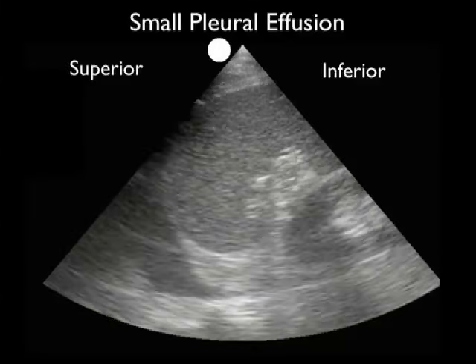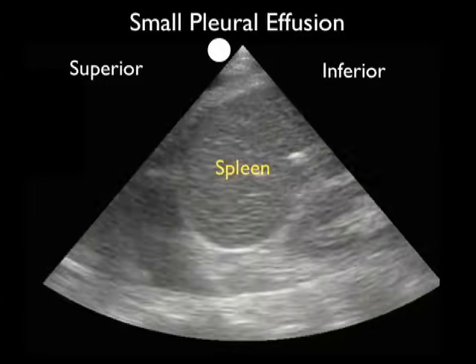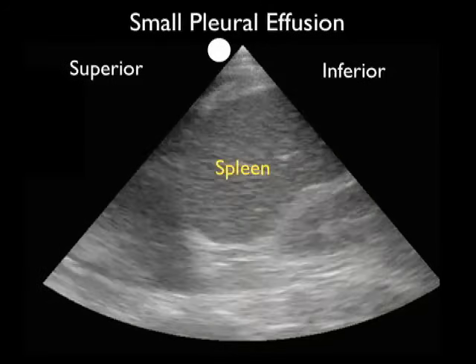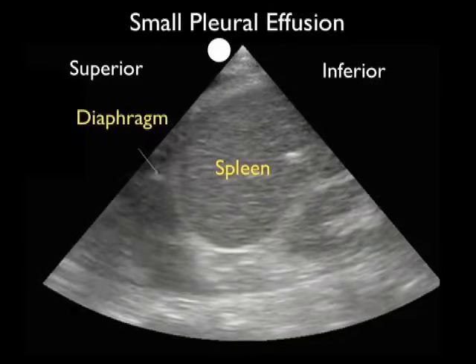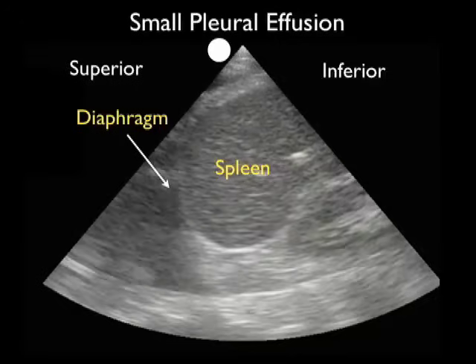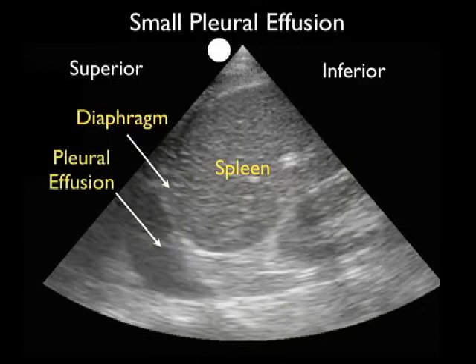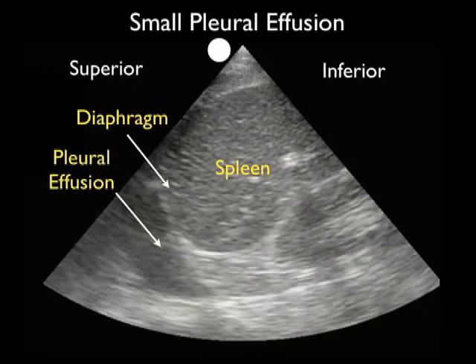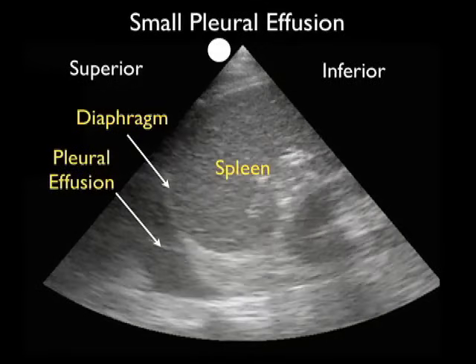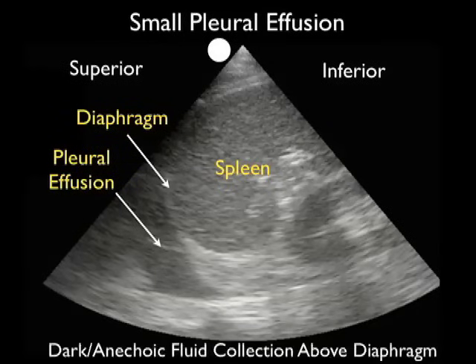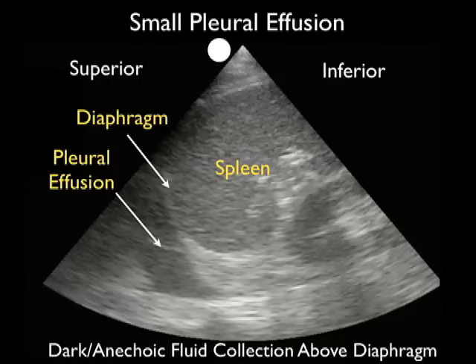Here's a video clip showing a small pleural effusion as taken from the left upper quadrant view. We see the spleen in the middle of the image, the kidney inferior to the spleen, and the diaphragm — the curving white line moving up and down as the patient breathes — right above the spleen. As we look into that area above the diaphragm, we appreciate the presence of a dark or anechoic fluid collection above the diaphragm. This represents a positive pleural effusion. Notice the amount of fluid is relatively small, and we can actually see the lung moving up and down to the left of the image.